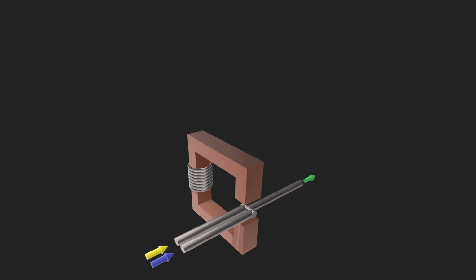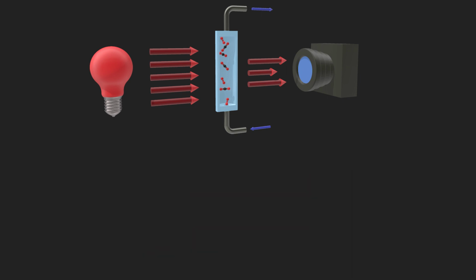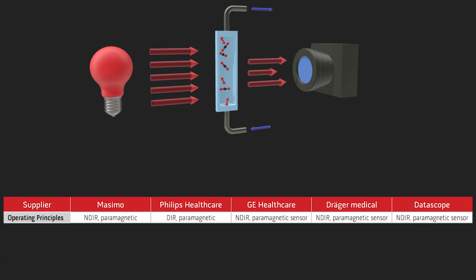It consists of a paramagnetic analyzer to detect oxygen and a gas phase infrared spectrometer for all other gases. Because oxygen does not absorb infrared light, it cannot be analyzed by infrared spectroscopy and requires its own analyzer. For this discussion, we will concentrate on infrared spectroscopy. Note that this discussion applies to all modern anesthetic gas analyzers, as all major companies that offer analyzers utilize IR technology.